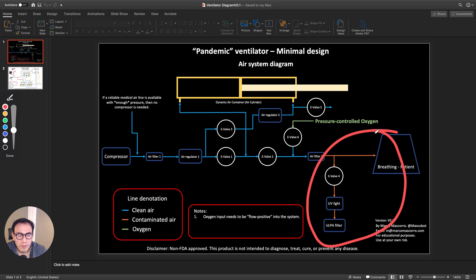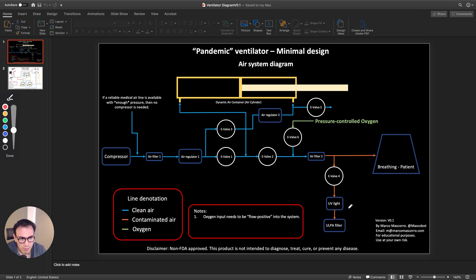The contaminated air doesn't flow back into the clean section because a valve closes it off, and the pressure of the incoming air also pushes it the other way, keeping it contained. One critical point I keep hearing in conversations is that you need to filter the exhaled air from the patient because it's contaminated and you don't want to spread it in a room. In this design I'm using a ULPA filter — ultra-low particle — which filters down to 0.12 microns, compared to HEPA filters which filter at 0.3 microns, so it's more efficient.